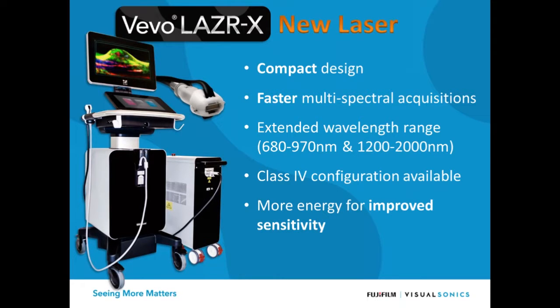But we also had a lot of requests to use this, for example, on larger animals like pigs, animals that won't fit inside the enclosure. So we've decided to have a configuration where an enclosure is not necessary. Of course, you've got to have the proper laser safety officers there and the proper protective equipment like safety goggles, but now this allows you to use it essentially as a handheld photoacoustic imaging device to scan larger animals like pigs, and possibly even doing some human studies under the proper ethical guidelines that have been established through an IRB, for example.